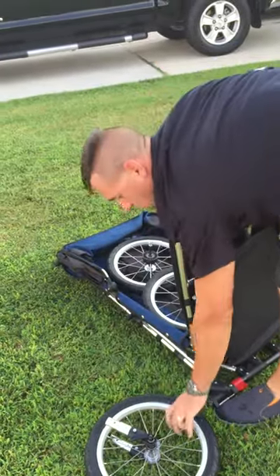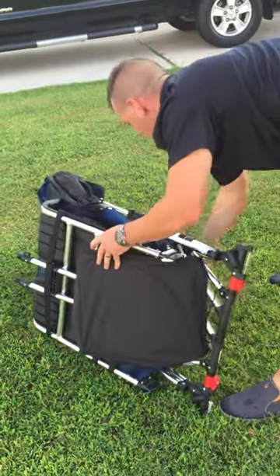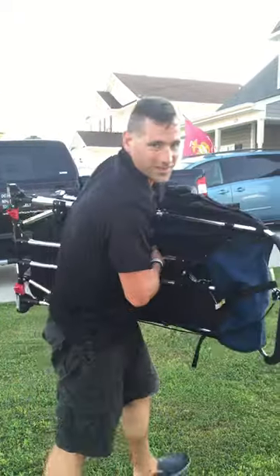We recommend you store your tires inside your freedom chair — one, two, three — fold her down. You could take a bungee cord to keep it all together, but otherwise you're ready to go. Thanks!